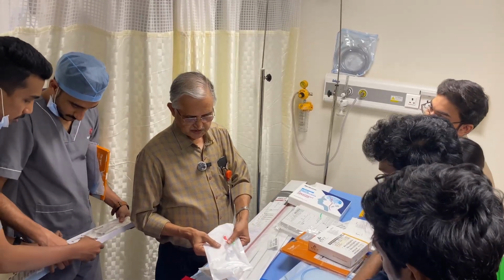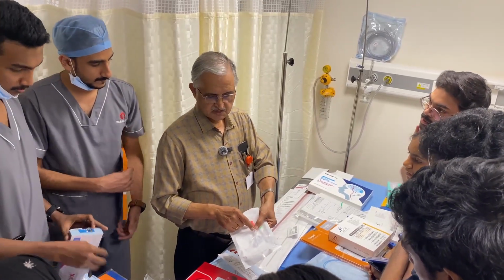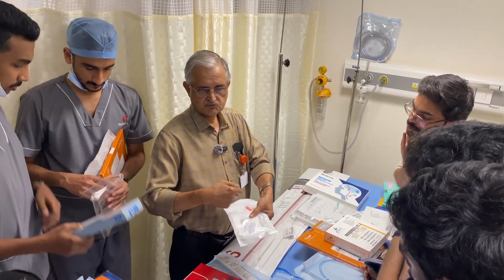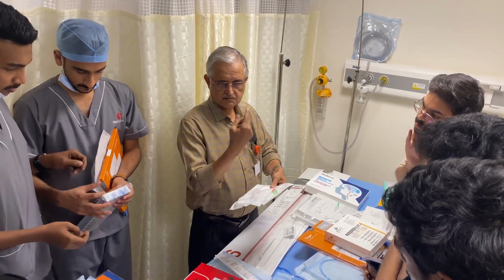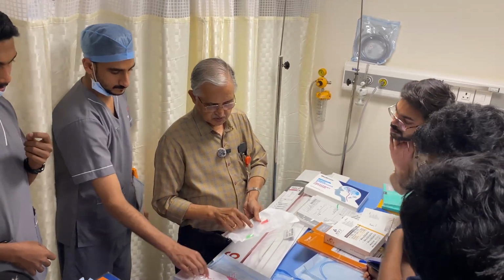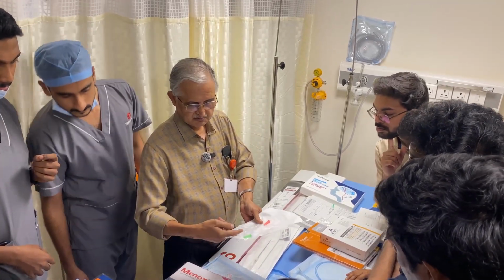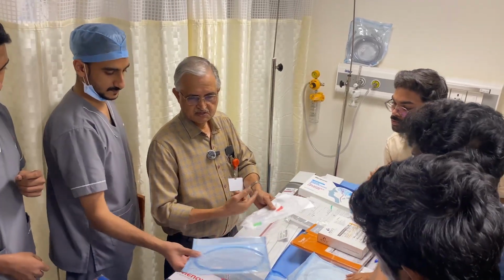Here you use this kind of connectors to the outer guiding catheter, so that you can use the other ports. One will be irrigation port and the other you can use for introduction of your microcatheters also, 1 or 2 microcatheters you can pass. And through this long sheath, if you want to introduce this very fine wire, you may use this needle. This needle has to go in, otherwise it will not be easy to manipulate these very supple micro wires inside.